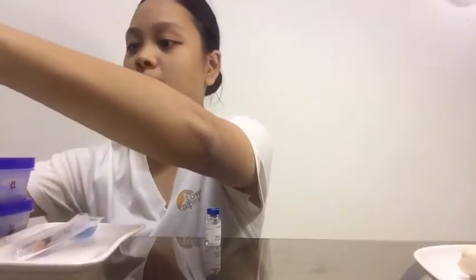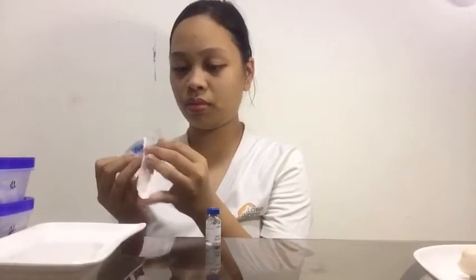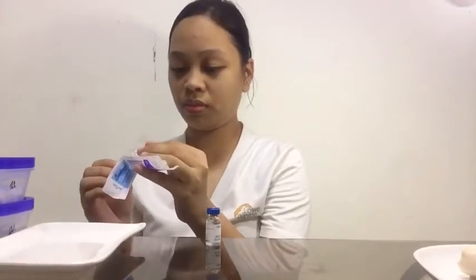And then dispose of your cotton ball. And then prepare your needle. So suppose we're going to withdraw 0.5 milliliters of medication. So we're going to withdraw 0.5 milliliters of air.